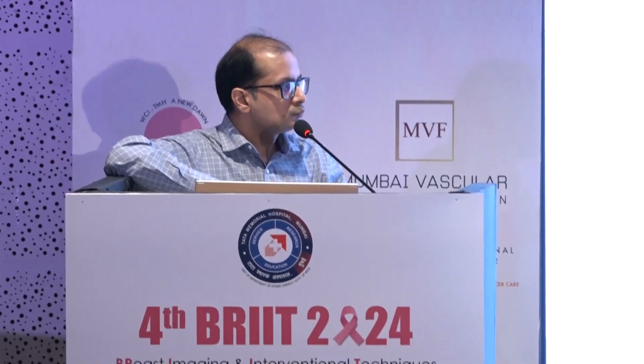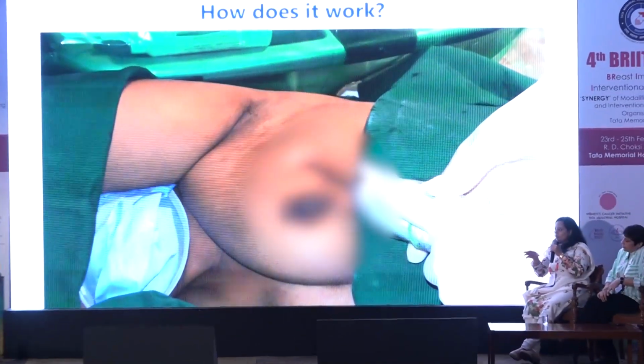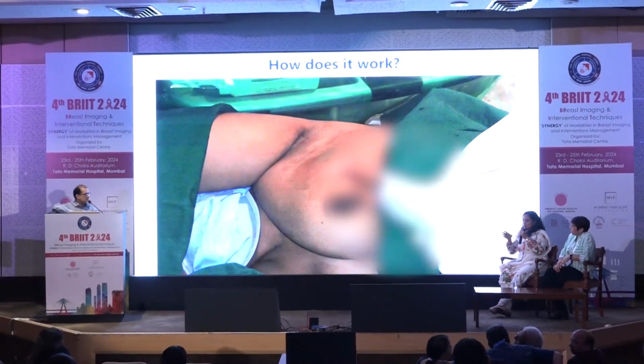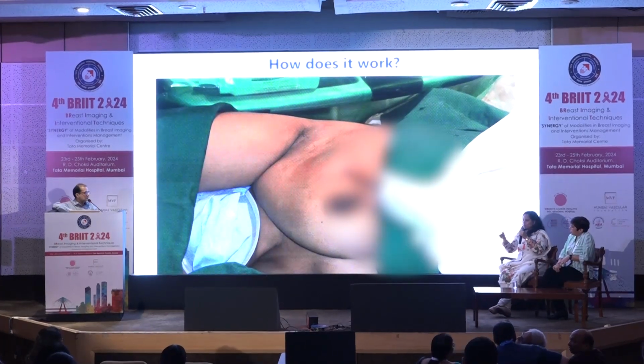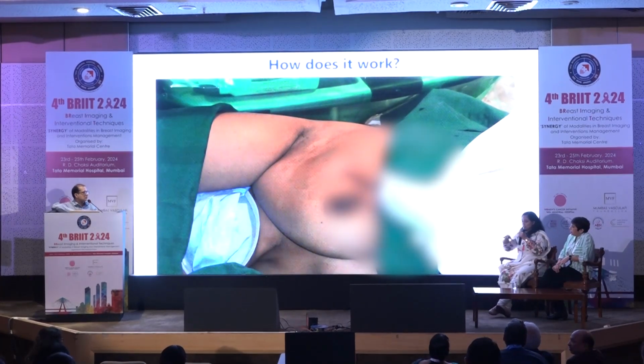Dr. Rupa, do you follow the same technique or is it different? Always use a 12 o'clock position. We don't change the clock positions on ultrasound. Rather, we actually use the maneuver to rotate it medially and laterally, because this has better control rather than changing the clock. So it is always 12 o'clock, and we move it maybe to 11 and 1, or for extremely large fibroadenomas at 10 and 2.